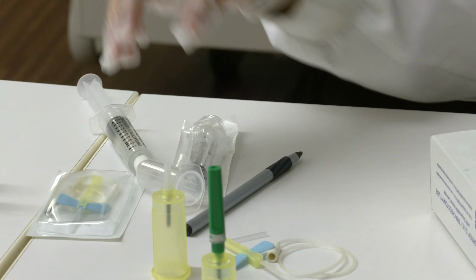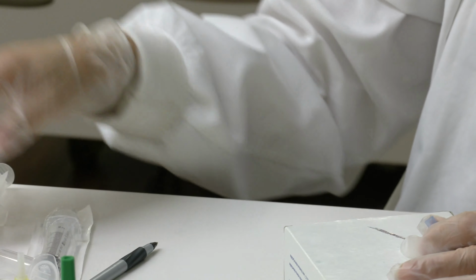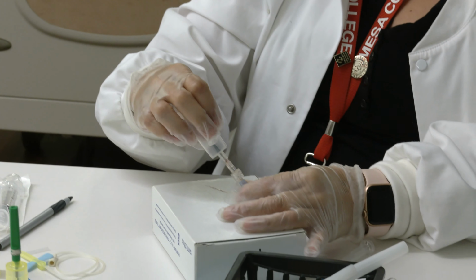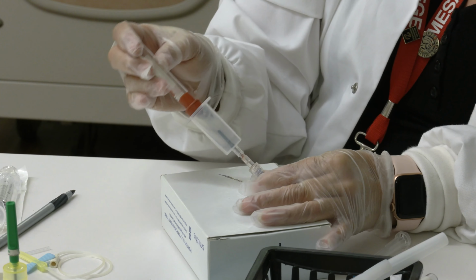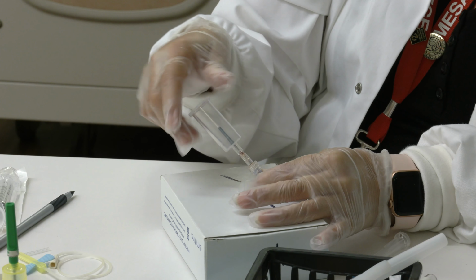You can use a syringe, hook it to the top, pull your blood out, or you can use one of these specialized Vacutainers that are made to lock in, and then you can again use your tubes. So either way that you feel is comfortable.